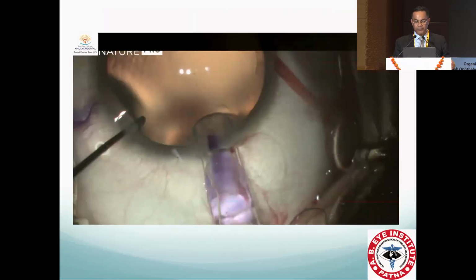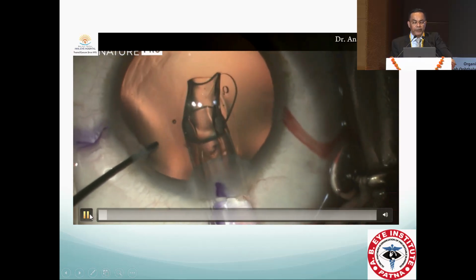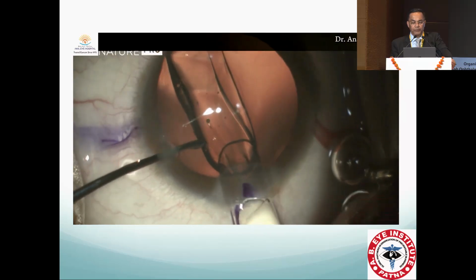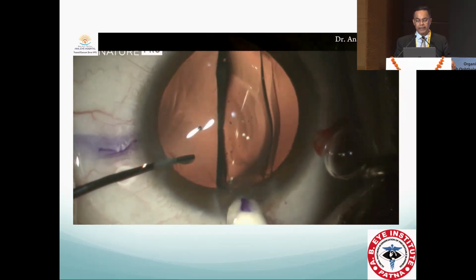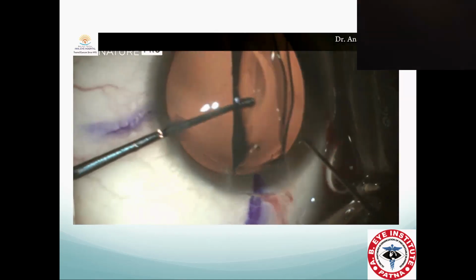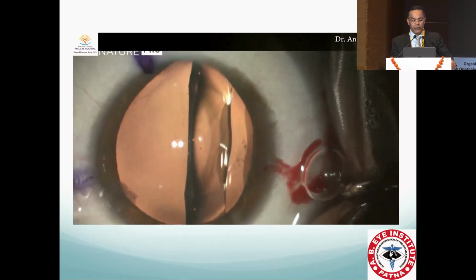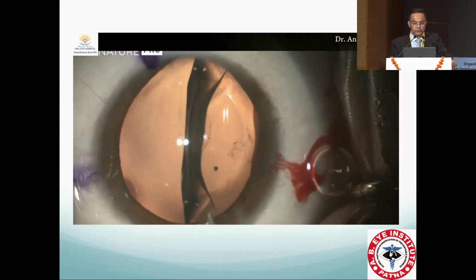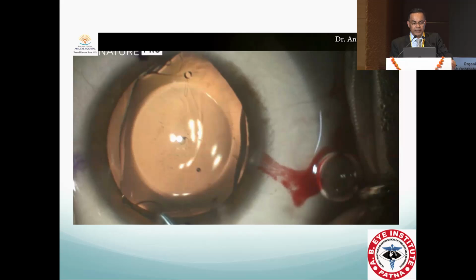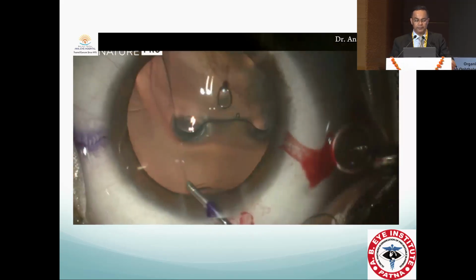So actually, I'm grateful to Dr. Anaga Harur. She has lent this video of when you put this ICL inside and you realize that you have not put it in properly and you have a difficulty. Once you have put it in place and you realize that this is not the correct placement, then instead of turning it around, it's very simple. You just pull it out like this instead of turning, as I had shown you earlier.